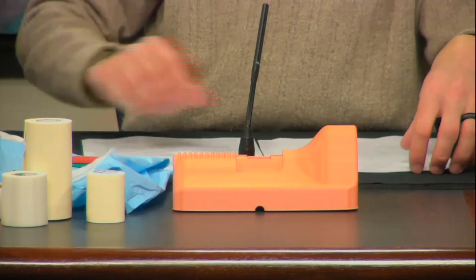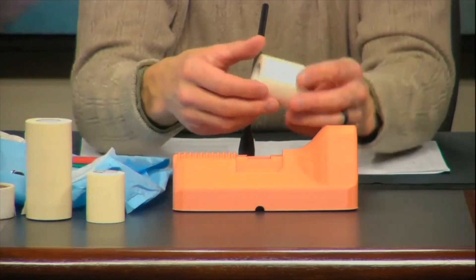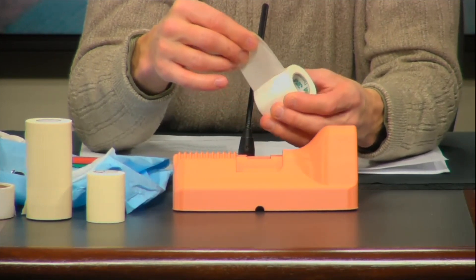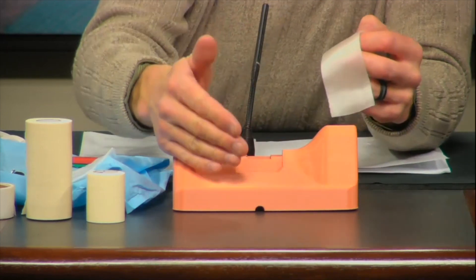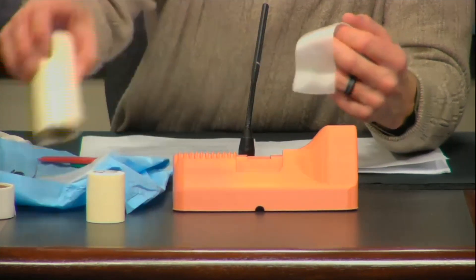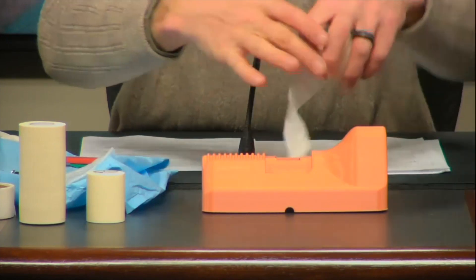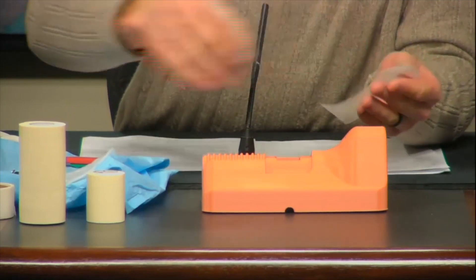Next we're going to use a piece of tape to simulate the membrane. I like to use a piece of white cloth tape or medical tape, but it doesn't really matter — foam tape is fine, any kind of vinyl tape would work fine. The type of tape isn't important. I like to use something white because we use foam tape as the skin, and it's a different color, which gives you two distinct layers as you work through the procedure. For the membrane tape, cut a piece three to four inches long and put a piece of backing on that.